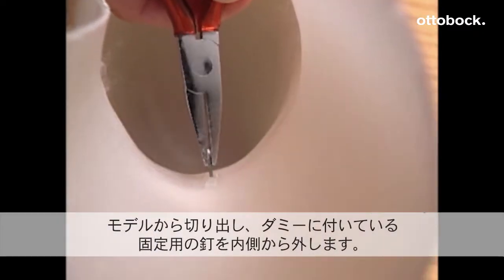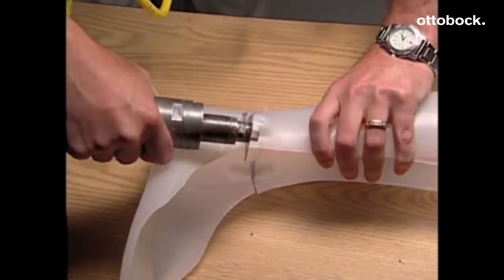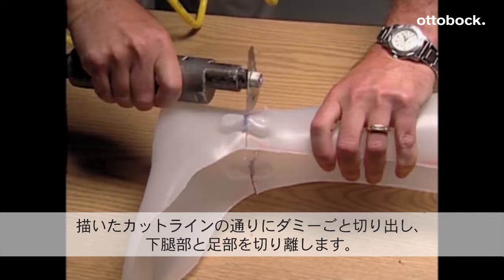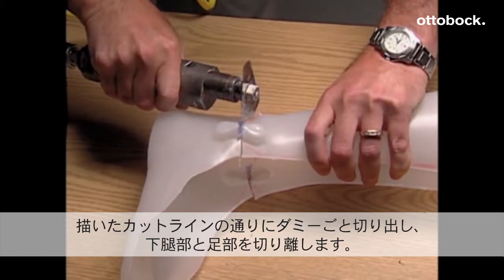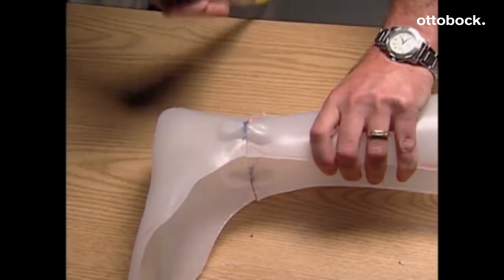Before cutting, remove the brad from the inside of the AFO. To separate the AFO into two sections, cut carefully on the established cut line and make sure you cut completely through the molding blank. Your cut should be aligned with the nail hole, leaving the grind lines above and below the cut line.